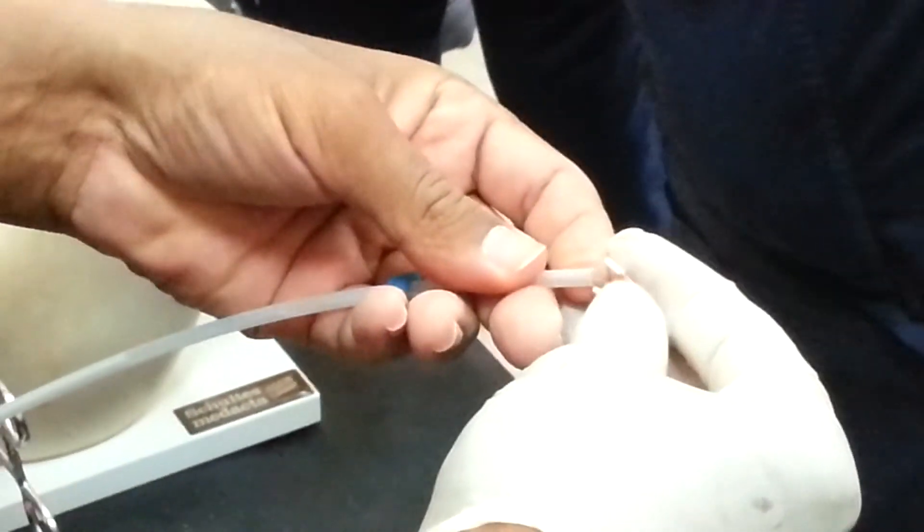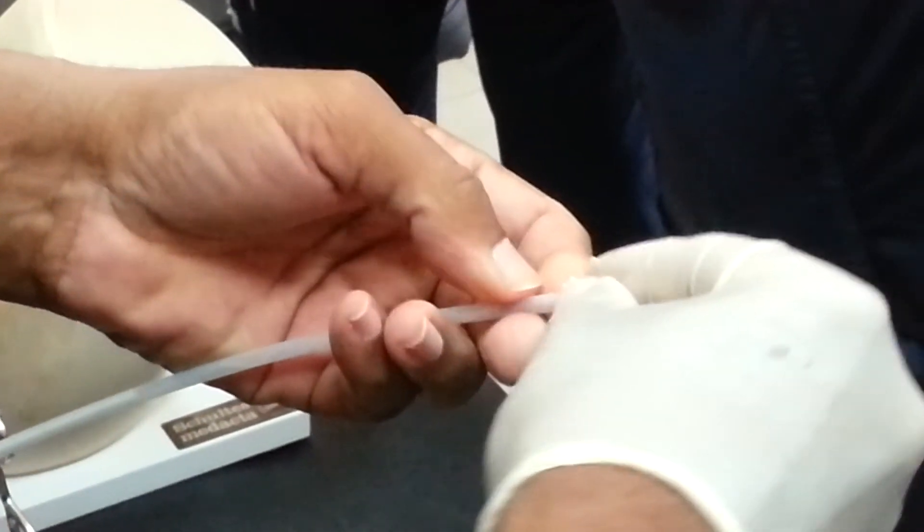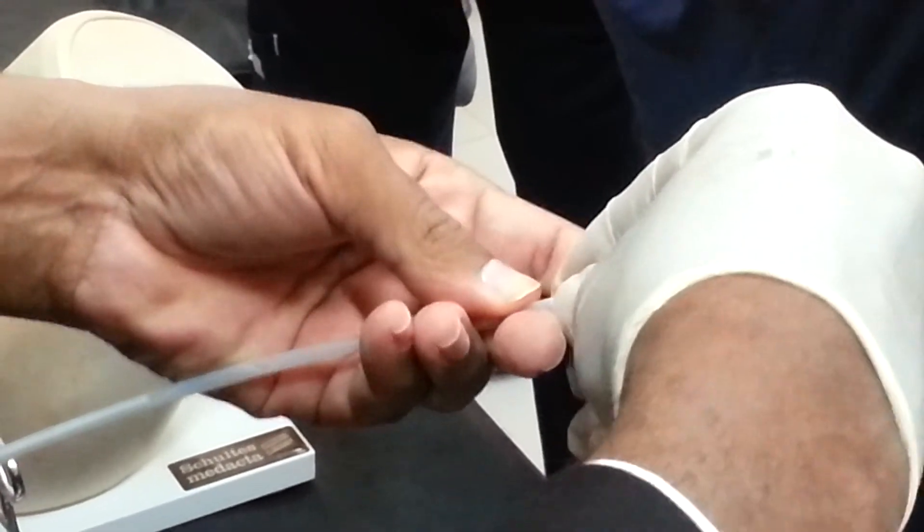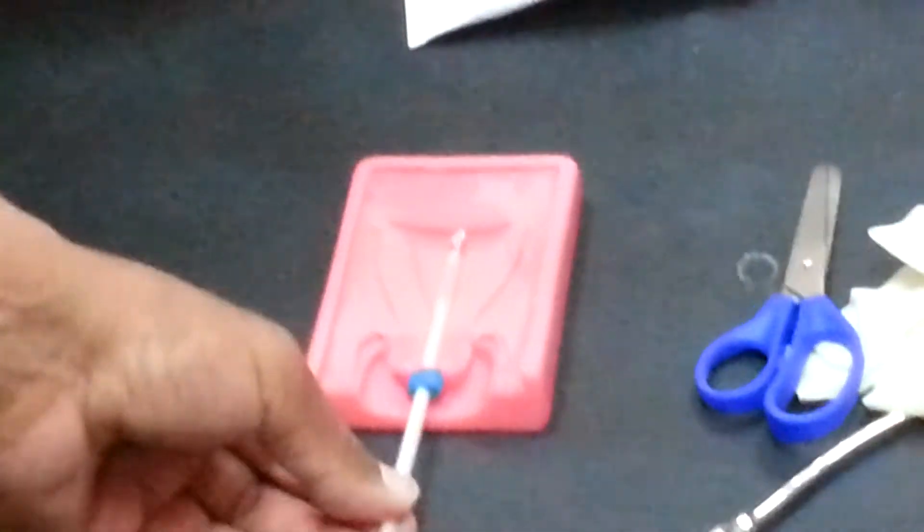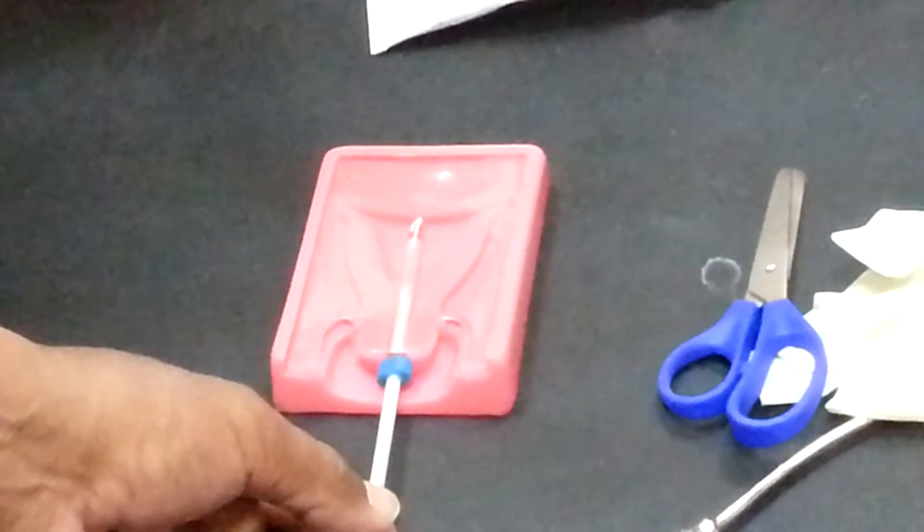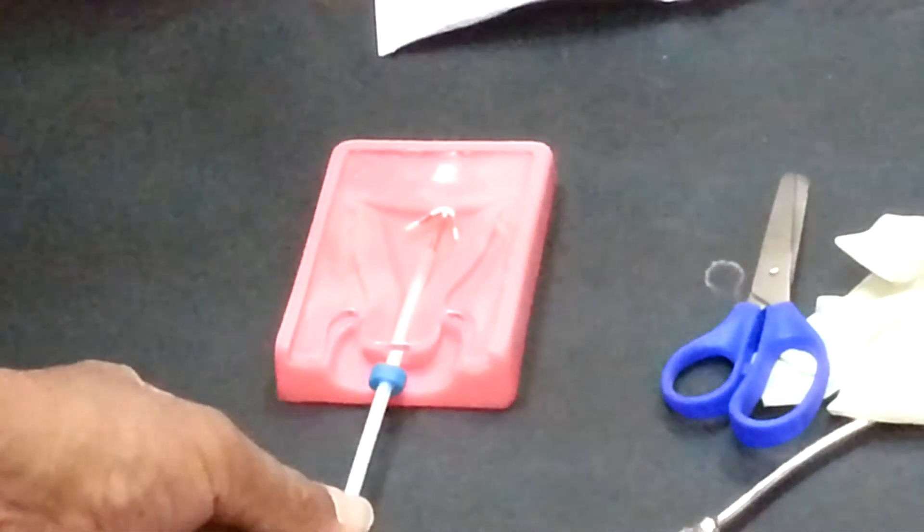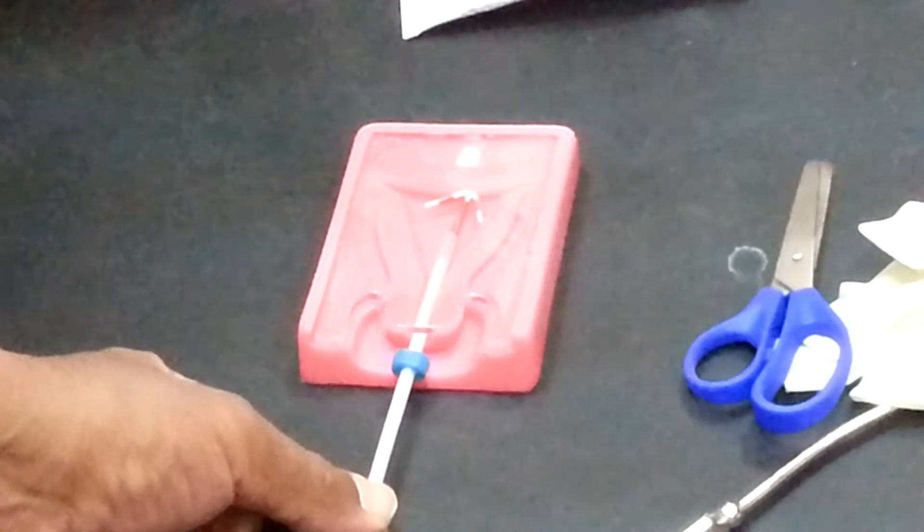Fold the tubing and insert it inside, like this. Come and put it inside and you introduce it up to this level. Then you stabilize this and move this, like this.